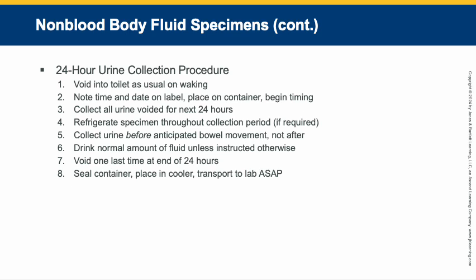Drink a normal amount of fluids unless instructed otherwise, and then void one last time right at 8 a.m. the next morning. Seal the container, place it in the cooler, transport it to the lab, and that is a complete 24-hour specimen.